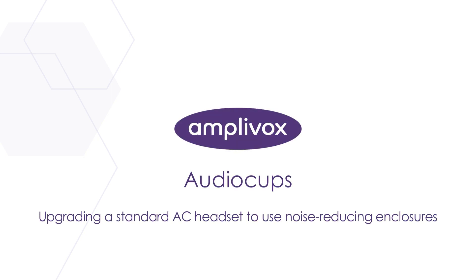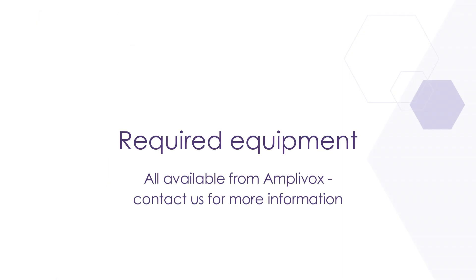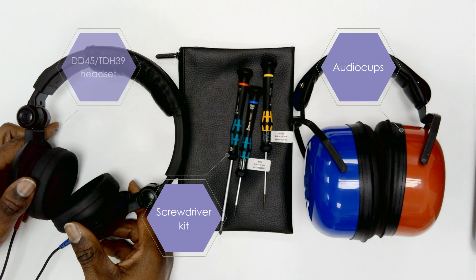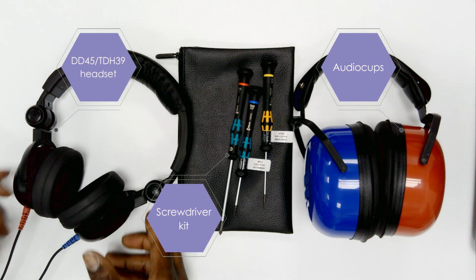Hello and welcome to this video which will demonstrate how to add audio cups to your existing DD45 audiometry headset. Before we begin, ensure you have the following items and tools required to perform this task.